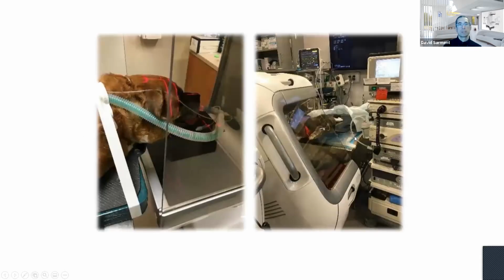So how does cone beam CT work? In the case of the VetCat, you bring the device to the patient. You position the patient. Usually the patient will be under general anesthesia. There are lasers as part of the device to roughly position the patient. That takes usually about 10, 20 seconds after you've done this a few times. So you roll the device over to the procedure table. You prepare the device in such a way that it's positioned properly using those lasers, and the lasers tell you where the image is going to be. And then you go ahead and scan the patient like we saw earlier in the video.